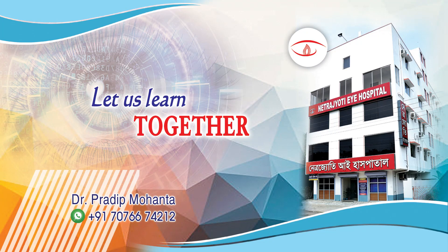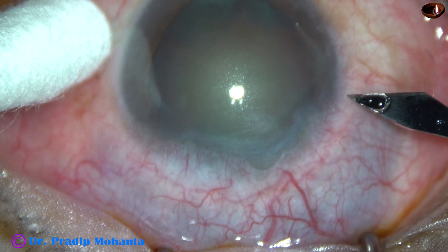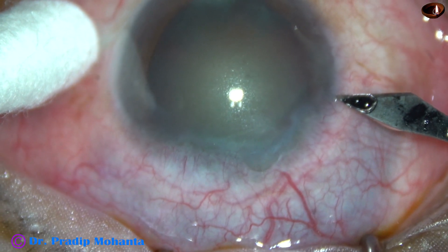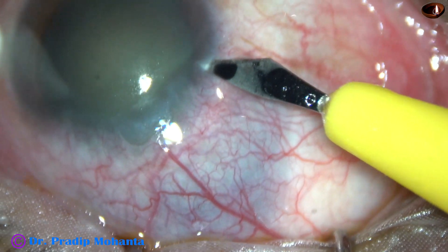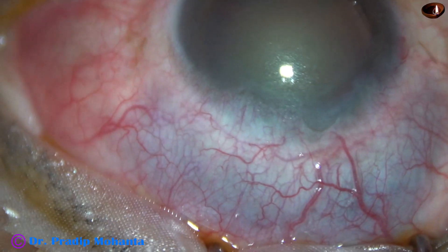Friends, welcome to my workplace at Rana Ghat, West Bengal, India. This is a cataract with grade 4 nuclear sclerosis. The sclera is not healthy — it appears that the sclera is very thin from 10 o'clock to 1 o'clock.